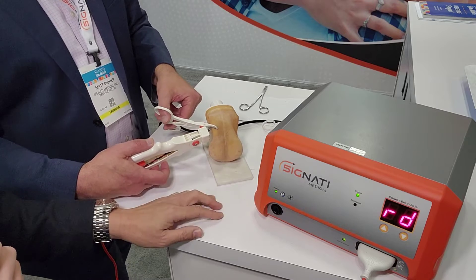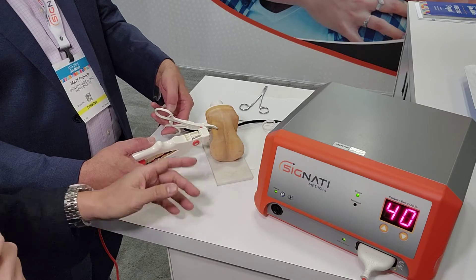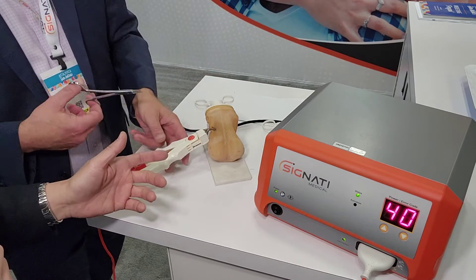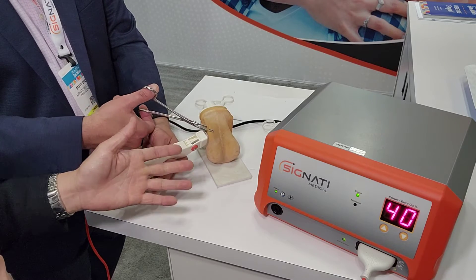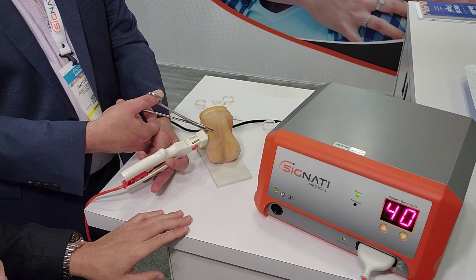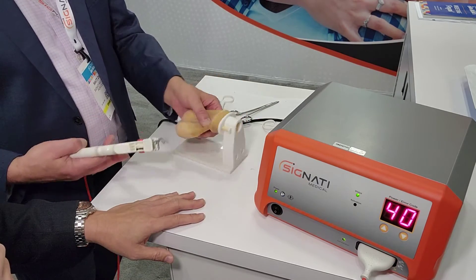The vas is divided, the skin is divided, the fascial layer is divided, the cremasteric muscle is divided, and the vessel is divided. You can then remove the clamp, and if you want a piece of the vas — for those not completely following AUA guidelines — you can use this special device to punch through the opening and also obtain a piece of vas deferens tissue for sampling. You would then do the other side after local anesthetic and perform the procedure on the contralateral side.